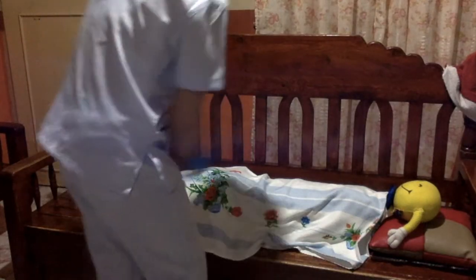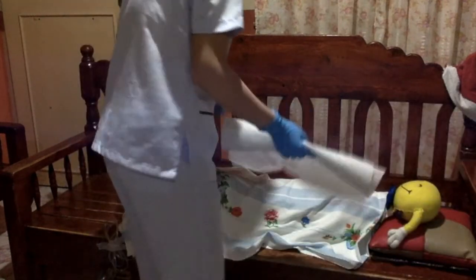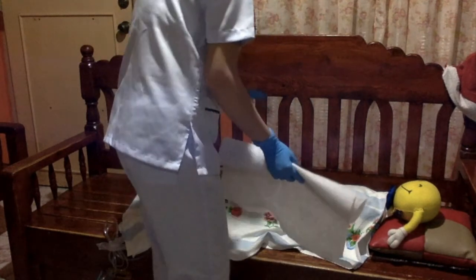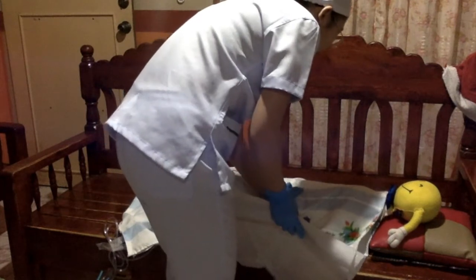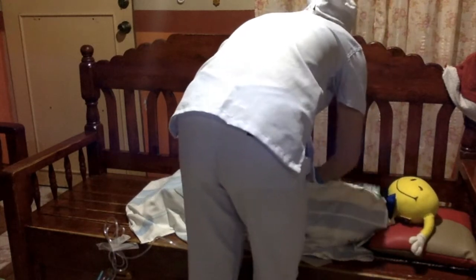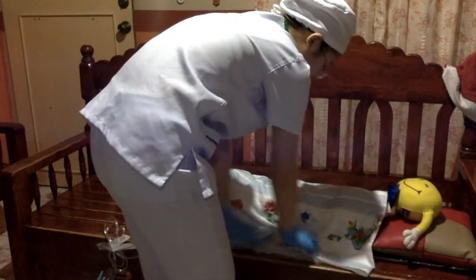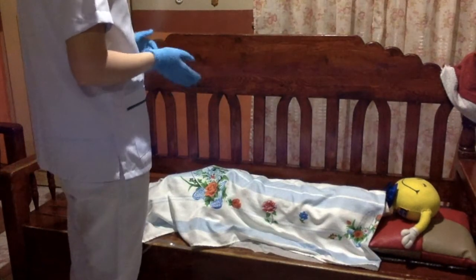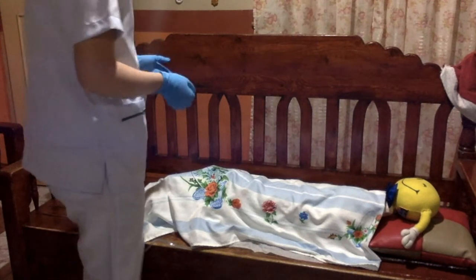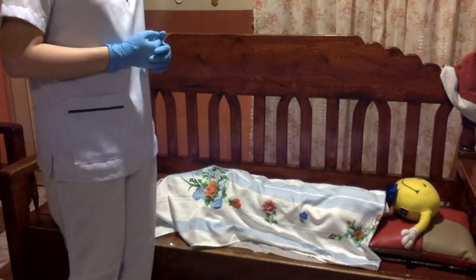I will now don non-sterile gloves to prevent microorganism transfer and exposure to patient's body fluids. I will lower the side rails and place the linen saver under the patient's buttocks. Ms. Smiley, pakibend lang po yung dalawang tuhod at hawak lang po kayo kay nurse na nasa kabilang side para pag-ilid po. This position is called dorsal recumbent position. This allows access to the perineal area of the patient.